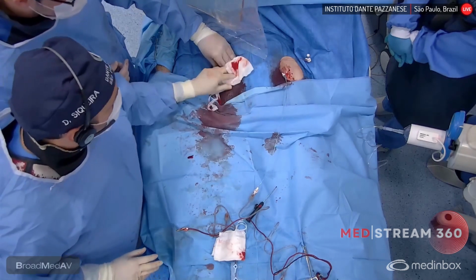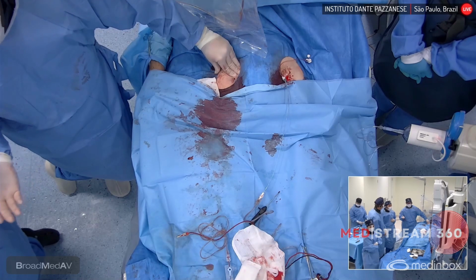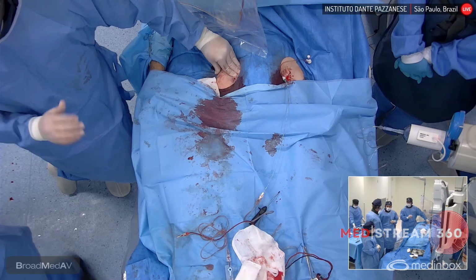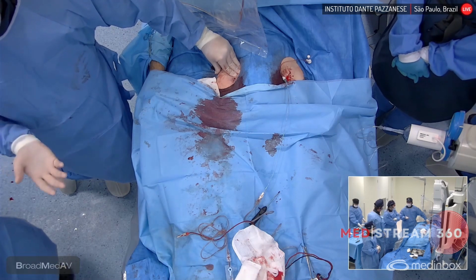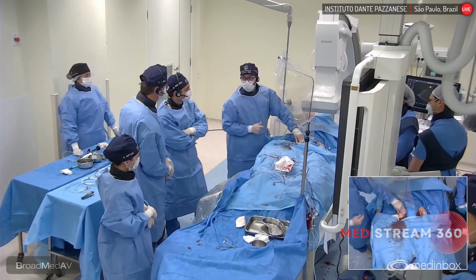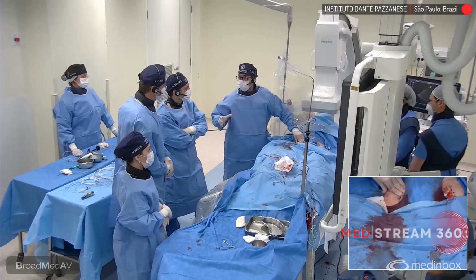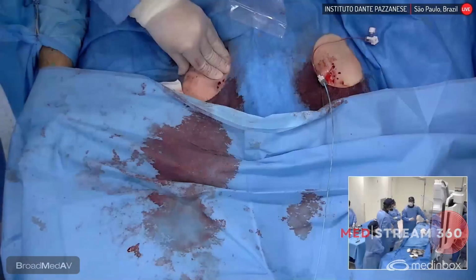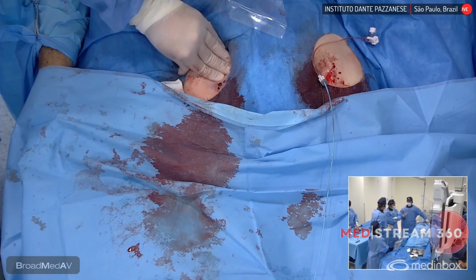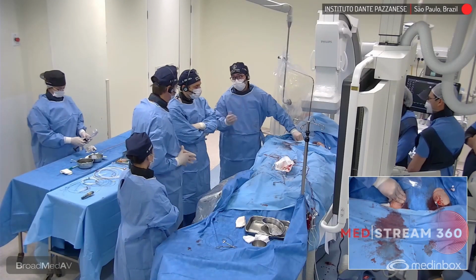What can you do to avoid a vascular complication in a patient like this, Alberto? When we have no calcifications, in my opinion, the access goes better than when we have calcifications. In this particular scenario, we have no calcifications in the stenosis point, the 5.2. So we performed a contralateral protection. If we have an accident, we are able to go with a balloon. So if you have a complication, what do you do with this? We go with a balloon, like a 5 to 40 balloon. We inflate the balloon until we have a covered stent or surgery.